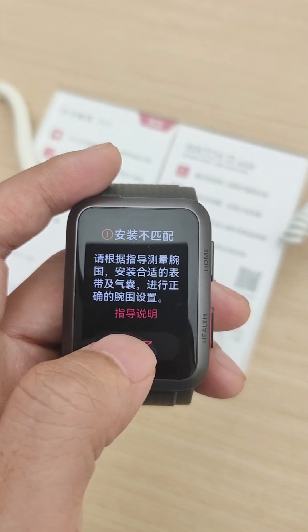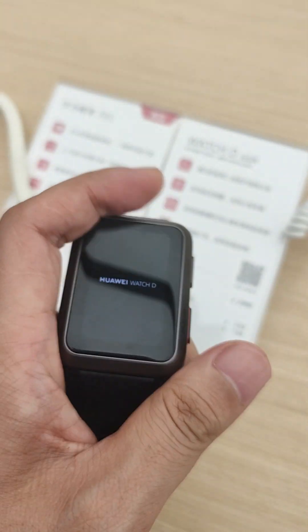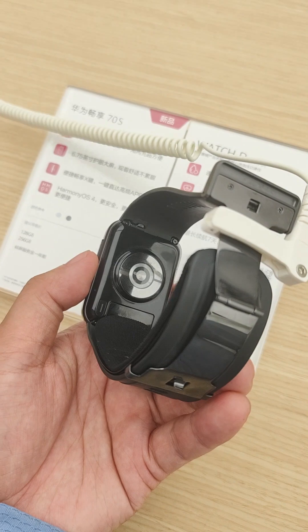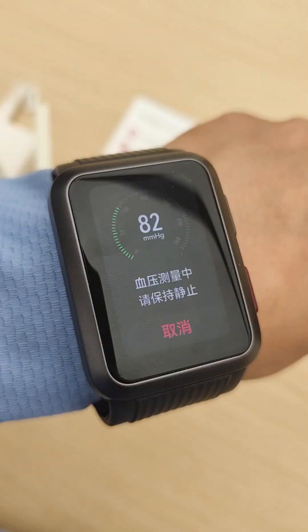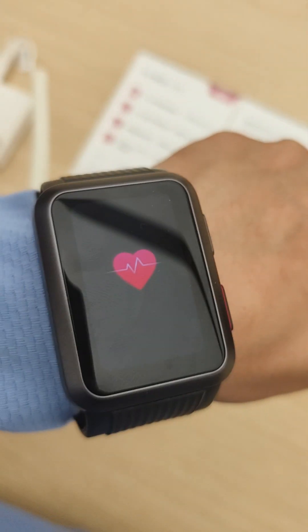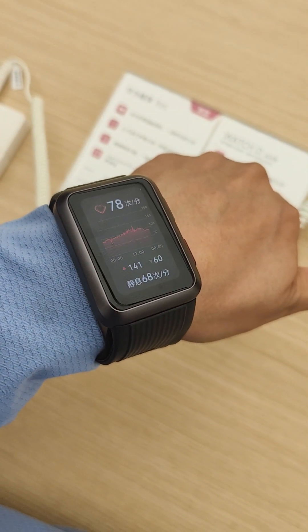You can set it on the wrist. There is a sensor at the back of the smartwatch, and it measures pressure as well as blood oxygen levels.